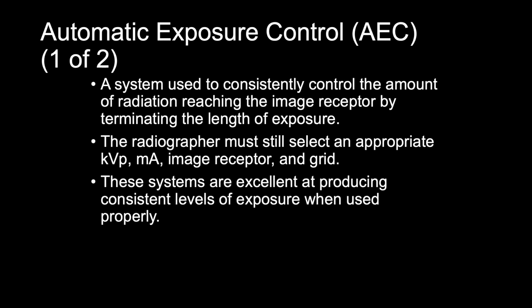As a radiographer, it is our job to select exposure factor techniques to produce quality radiographic images for all different kinds of equipment and patients. There are many combinations of KVP, MA, SID, exposure time, image receptors, and grid ratios. When combined with patients of various sizes with different pathological conditions and body habitus, the selection of the proper exposure factors becomes tricky.